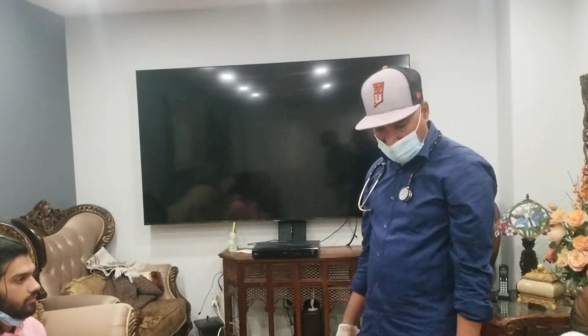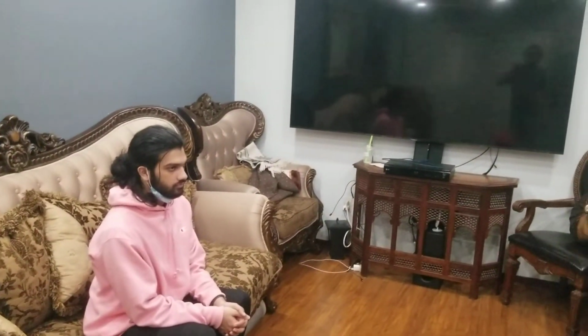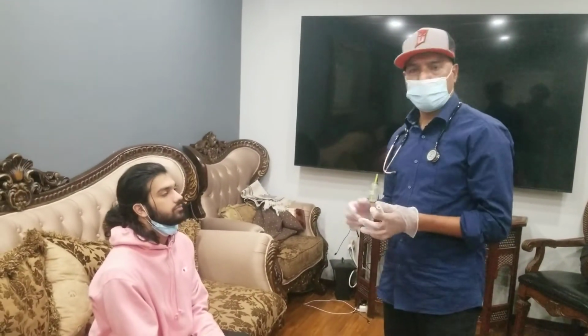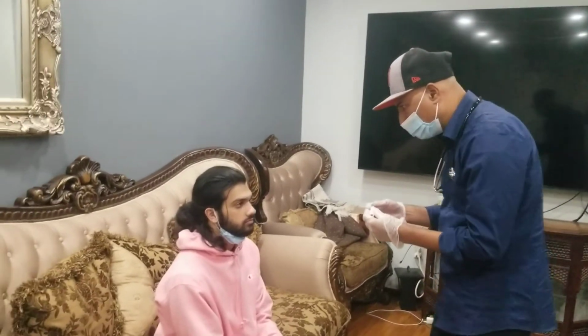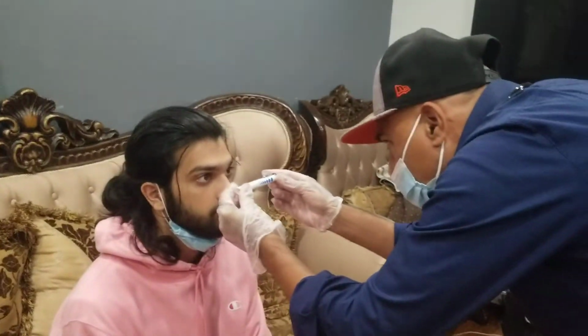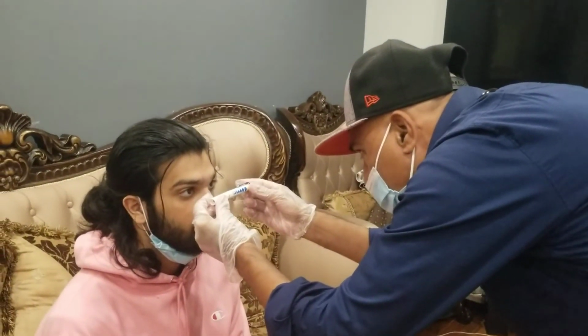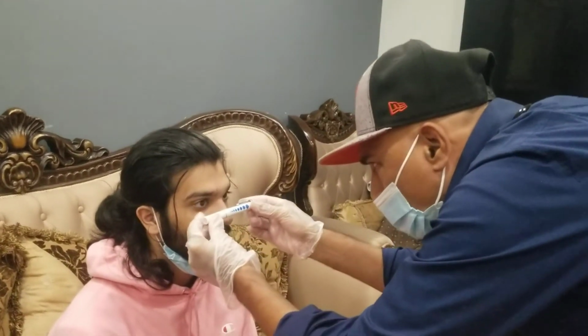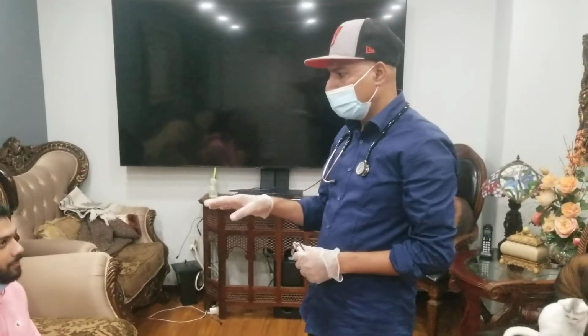For this test, I'll be using the pen light. Just take a pen light. Thank you. So now before I shine the light, I'm going to be checking Salman. Salman, please look at me. So I'm now trying to find the size of his pupils. The size of the pupil seems to be 6 millimeters, and both pupils are equal. So I can see that Salman's pupils are round. They are equal in size.